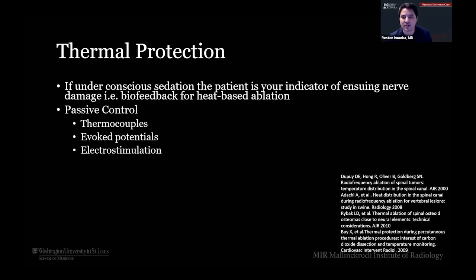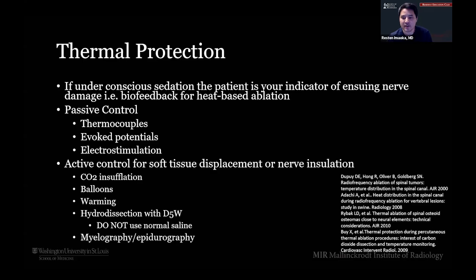So there's a couple ways to achieve thermal protection, right? You can talk about passive control, where you put thermocouples, which are just temperature sensors, close to something that you want to see and measure the temperature. Or you could do evoked potentials, motor or somatosensory evoked potentials, where you're stimulating the brain, seeing how long it takes for that muscle to contract, and you're measuring both the strength of the contraction, or the amplitude, and then also the delay, the latency. And then active control is you're actually doing something to prevent it. With the passive ones, you're just watching, but not really doing anything to prevent it.